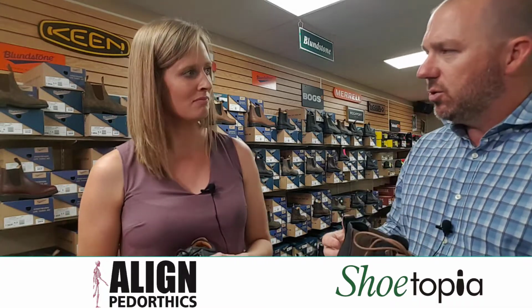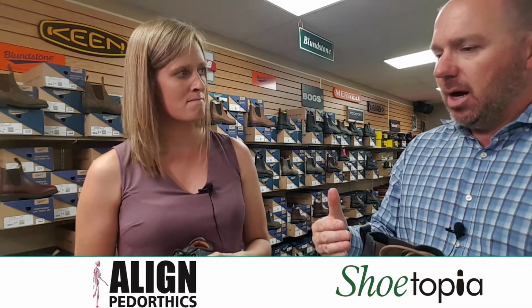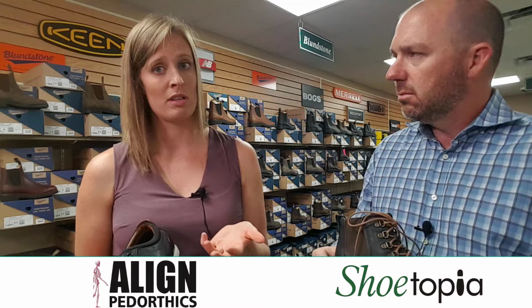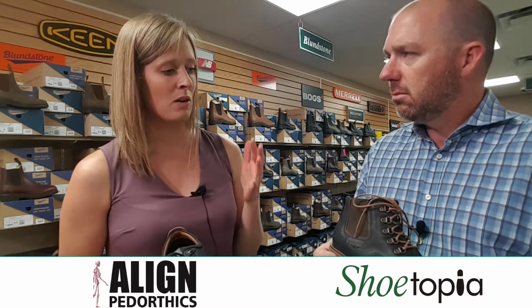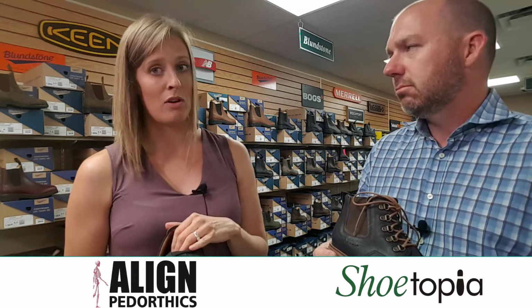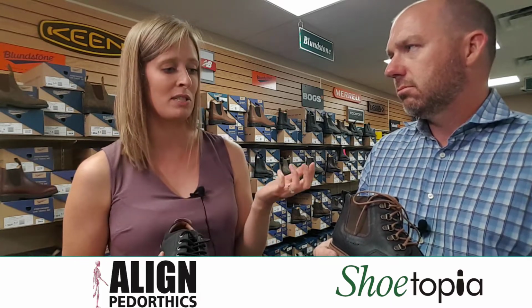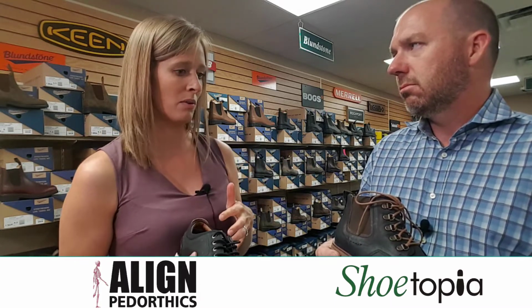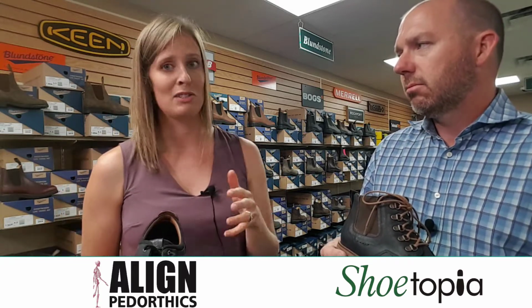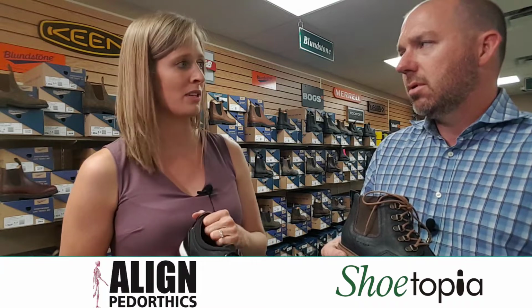Do you ever get people who already have them coming back for little minor adjustments and stuff like that? Definitely. So that is the one benefit of seeing a pedorthist, is that we can actually modify them on site. So I have a lab in the back of all of my clinics, and that allows me to do any minor adjustments that we maybe need to do, and it is fairly common to have that done. So don't be afraid to go back and see your pedorthist if that's what you need to do.